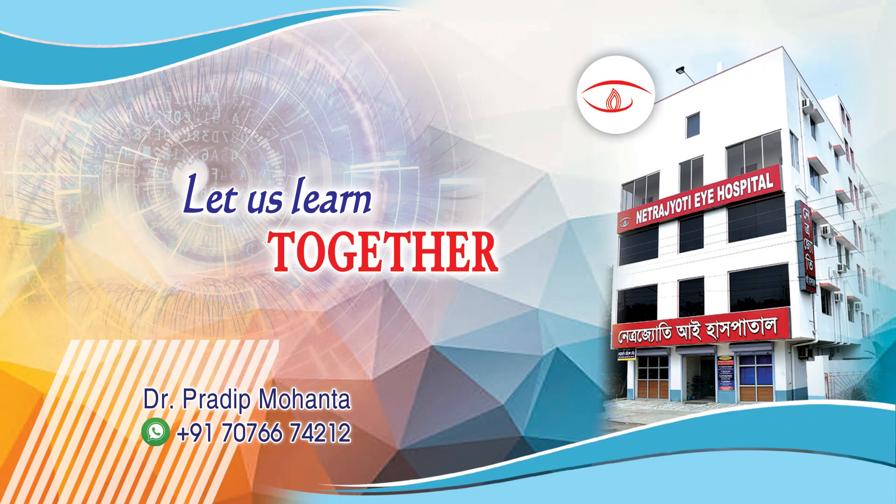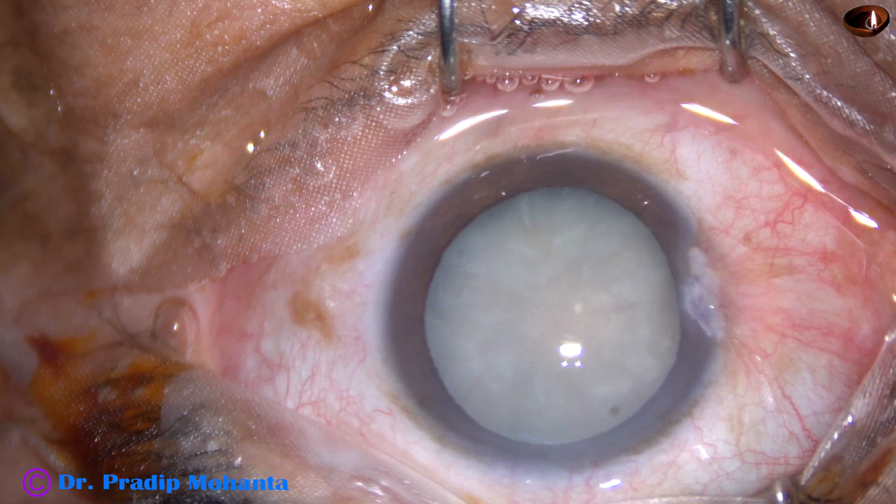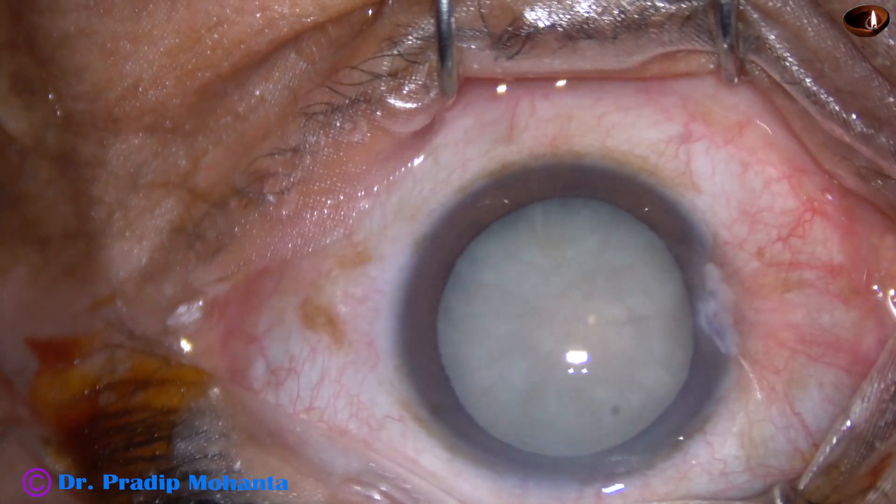Friends, welcome to my workplace at Ranagh Heart, West Bengal, India. This is an intumescent cataract and in this case I am going to show small incision cataract surgery for education.